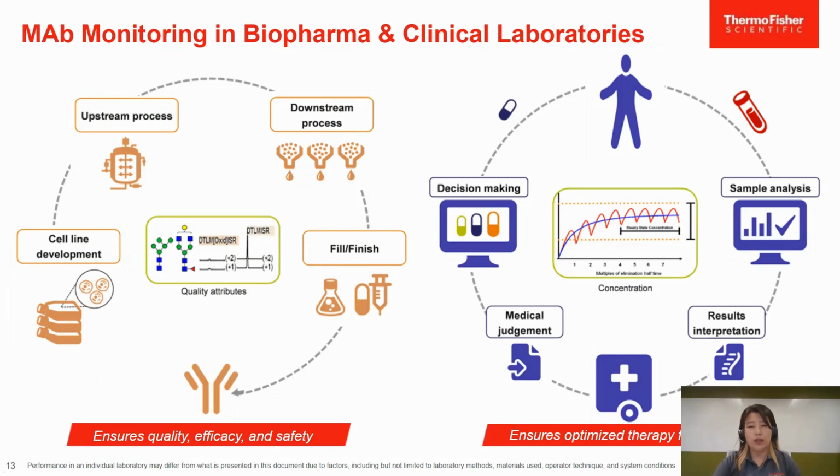After the sample analysis, doctors interpret the results, and with medical judgment, they decide the next dosing, because the concentration may not be within the therapeutic range, right? So throughout this cycle in the clinical laboratory, TDM measurement ensures optimized therapy for the patients.